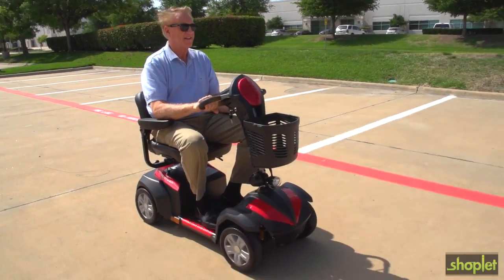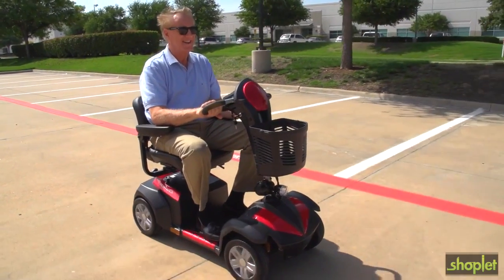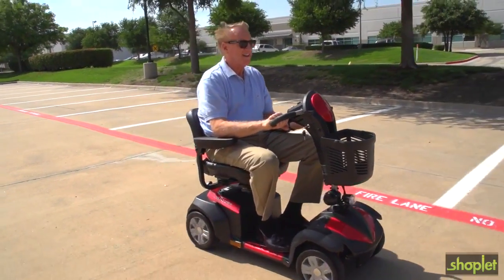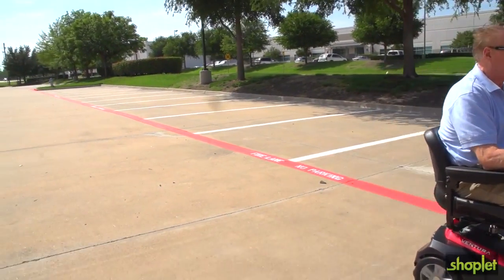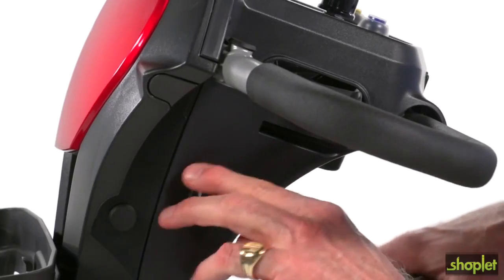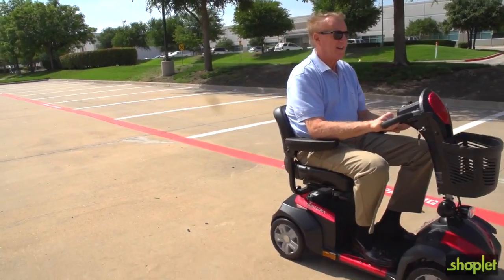With the Ventura four-wheel version, you get excellent all-around stability when traveling over outdoor terrain. Its 15 miles of travel range make the Ventura great for trips around town or around the neighborhood, and when the battery gauge shows the need for recharging, it's simple via the port on the control panel.